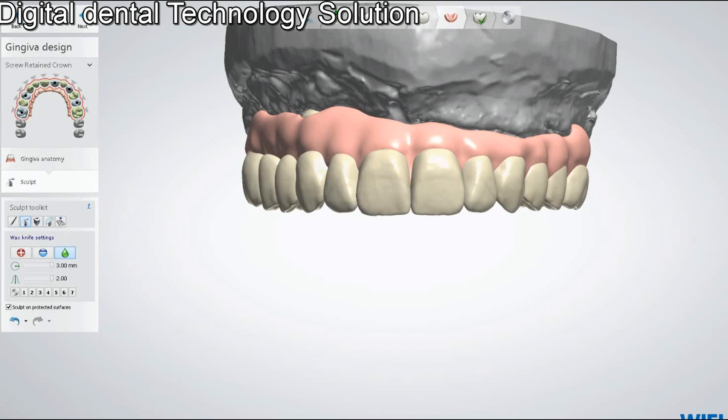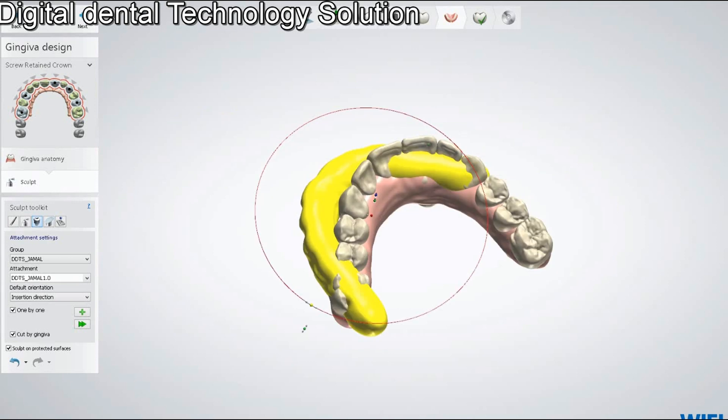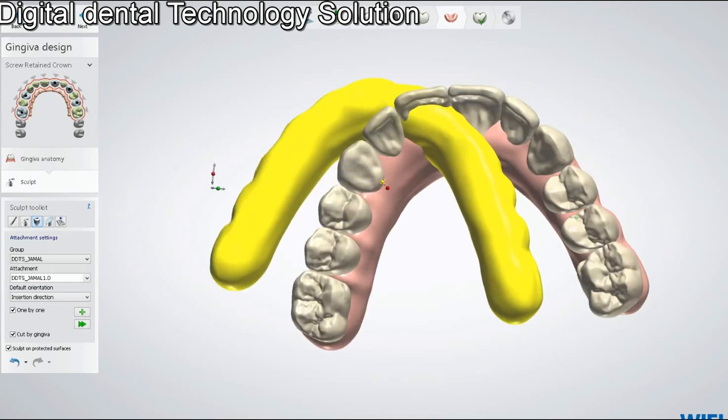You can scale it as you want, rotate it, and easily place it where you need. This attachment will help you make the gingiva in a fast way and save your time.